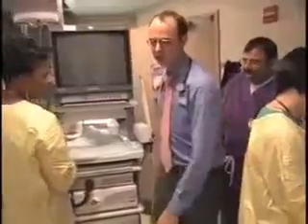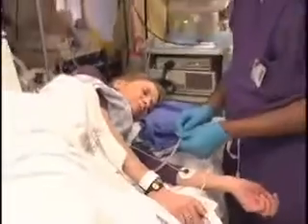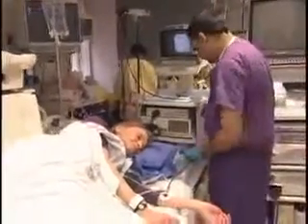Hi, I'm Dr. Robbins. Thank you so much for coming down this morning. Okay. So today we're going to do an endoscopy. So you've already had this procedure before, so it'll be very similar. You'll be lying on your side, and we'll have the anesthesiologist give you enough sedation so that you're totally comfortable.